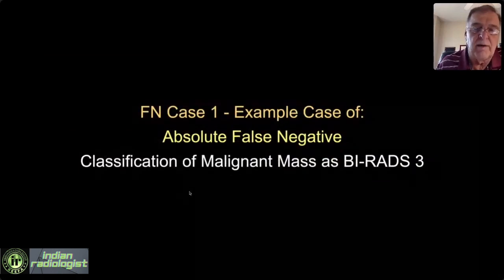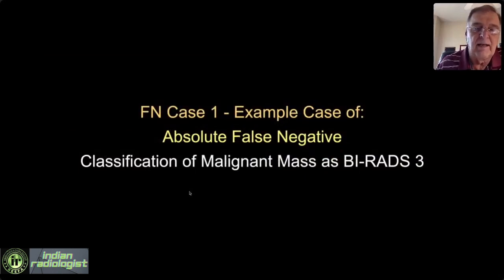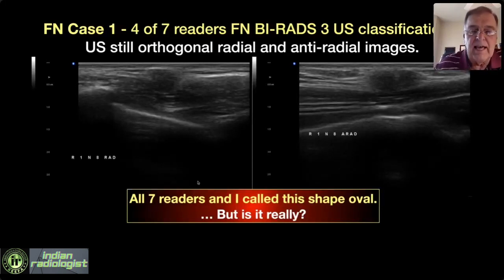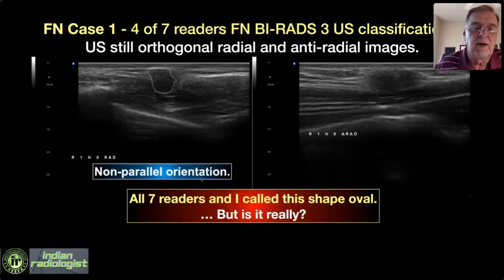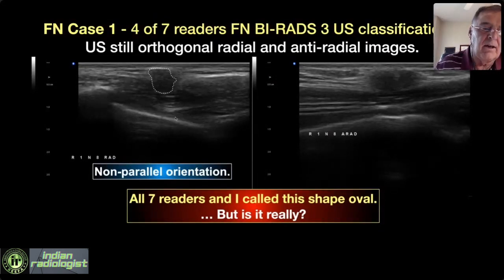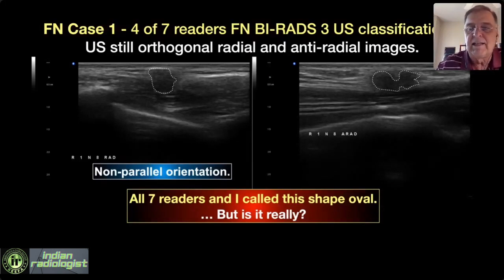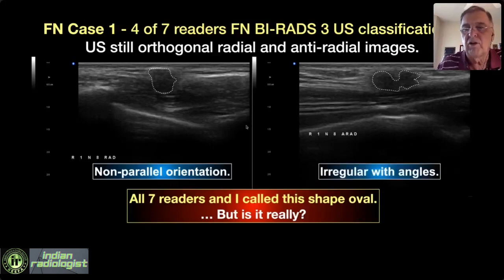False negative case 1 — an absolute false negative, meaning readers called this BIRADS-3 when it was malignant. Here are the orthogonal views of the mass. All seven readers and I called this shape oval. I don't know what I was thinking — because when I look at this, there is no way it should be called oval. Oval shapes should have a parallel orientation; if it's non-parallel, you can't call it oval. Clearly on the radial view this is not parallel, and even in the anti-radial view, we were just sloppy. We all blew it — we shouldn't have called this oval shape at all.